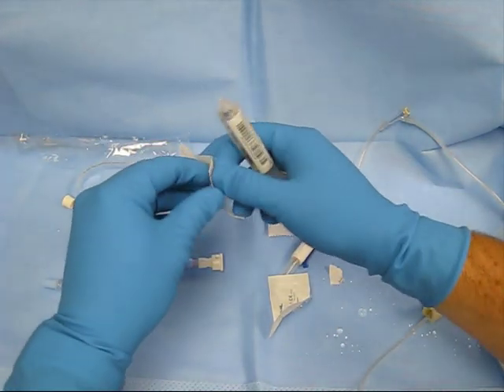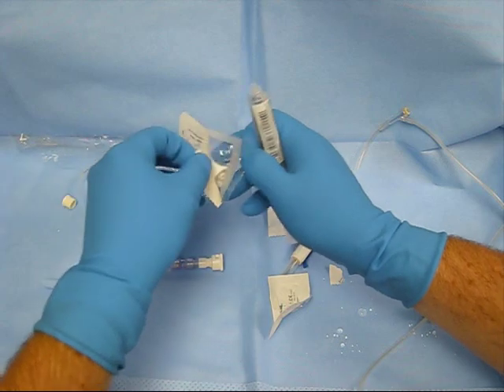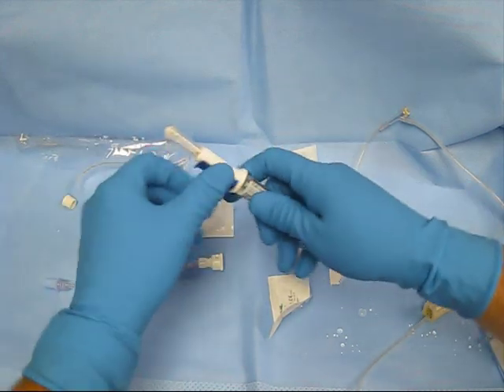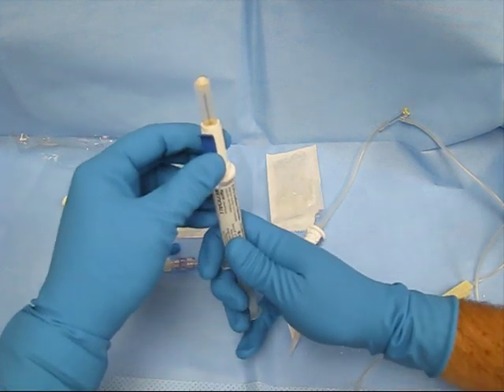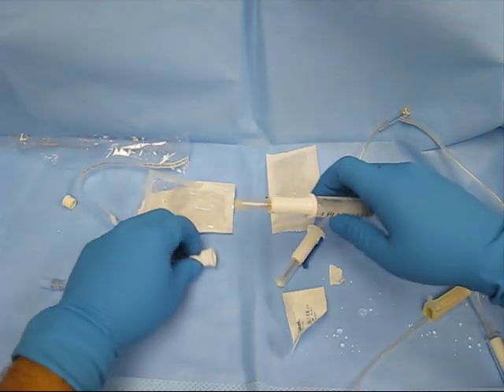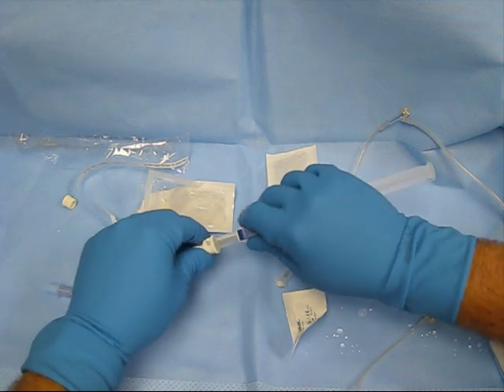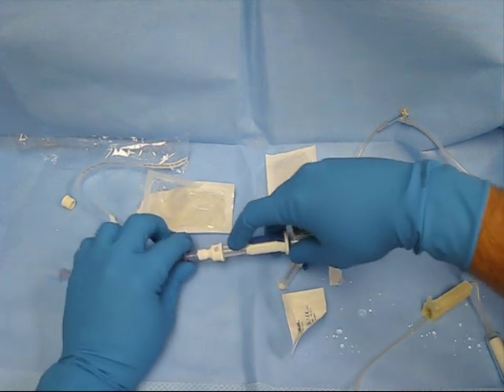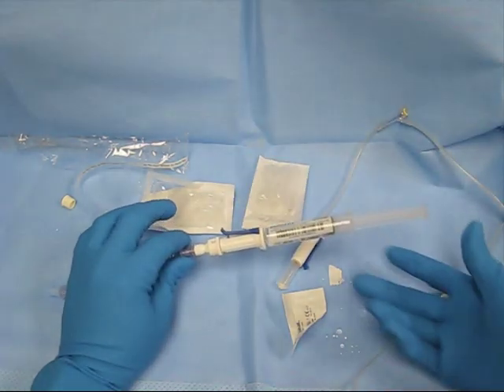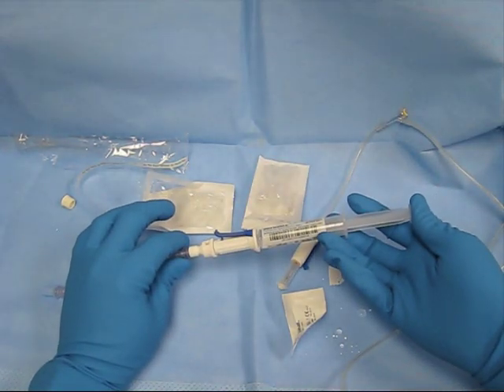Then take your saline flush and connect it to the second face seal needle. Make sure that you get your air out. Hook that up to the patient, pull back the blue actuator, insert the needle. You can now administer your flush.